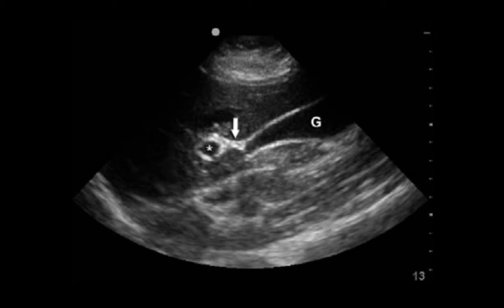The gallbladder neck has a fixed relationship to the main lobar fissure and the portal vein. The main lobar fissure connects the portal vein to the gallbladder neck, and the fissure can be traced between the two. In this image, you can see the relationship of the gallbladder, which is labeled G, and the portal vein, which has the asterisk, with the bright white main lobar fissure beneath the arrow.